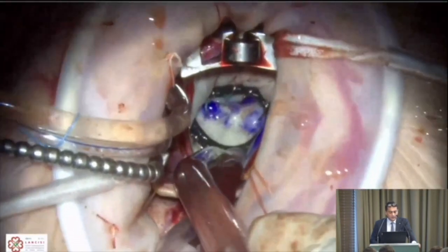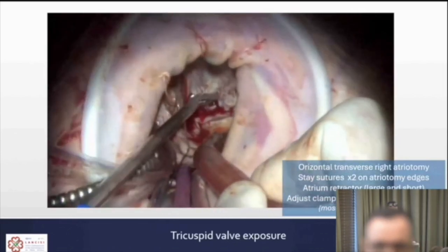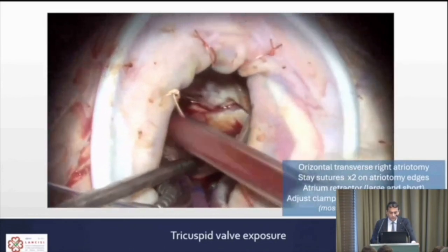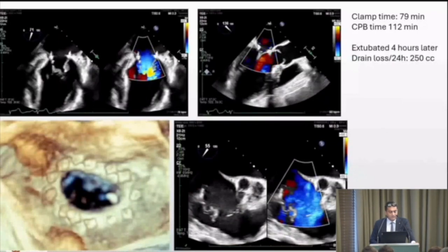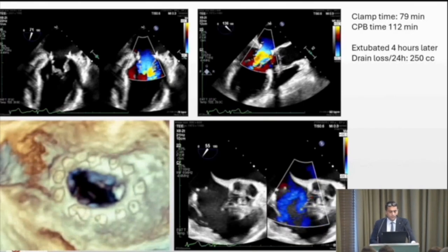We move to the tricuspid valve. Exposure is achieved with a transverse atriotomy using two stay sutures — one on the posterior and one on the anterior edge — and a standard atrial retractor. Adjusting the field by moving the cardioplegia cannula and clamp, you see the valve clearly: perpendicular, close, direct view. This is the final result of the tricuspid valve repair.